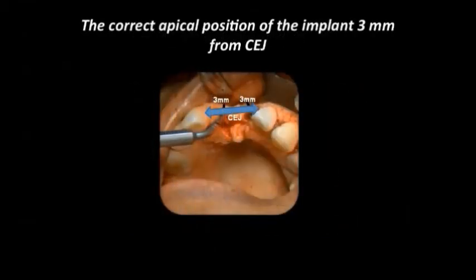Now, after we decided the proper location and proper drilling, we look at the cement to enamel junction, and we decided to go, as you can see here, 3 millimeter below the cement to enamel junction. So this is the location of the implant, which should be placed in the right location and the right 3D direction.